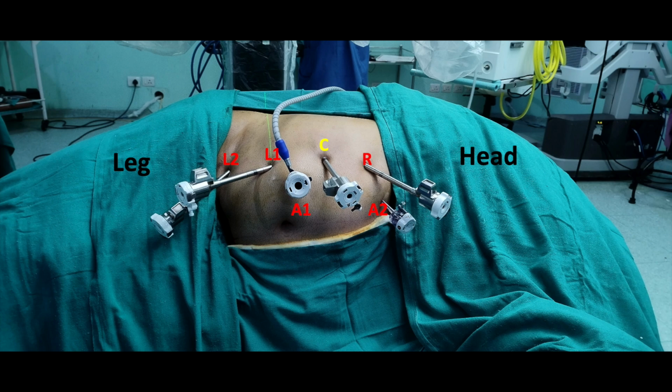The L1 and L2 ports are inferior to the camera port. These are used as left working ports. L1 I use for bipolar forceps and L2 I use for ProGrasp for retraction.